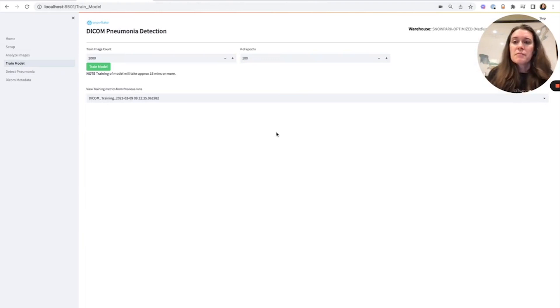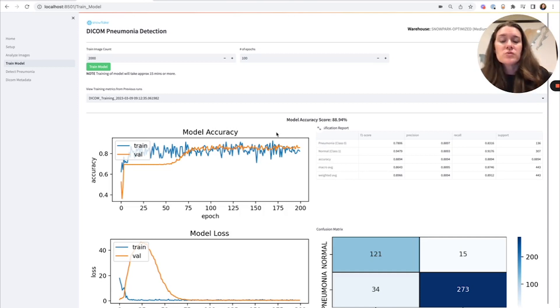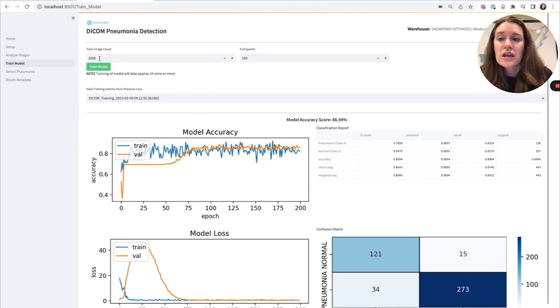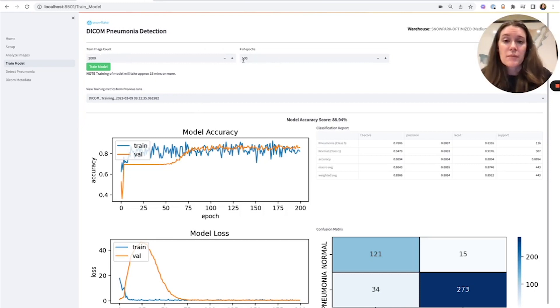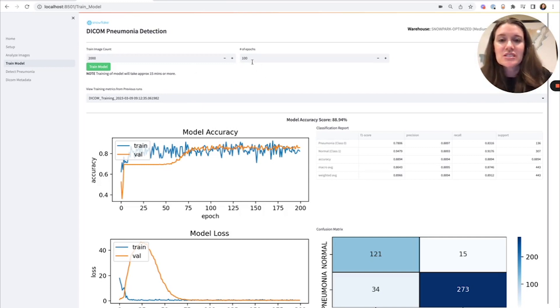When I want to train my model, I'm using TensorFlow. Here I have a couple of parameters I can set. The stored procedure to train the model has already been created, so I'm calling that stored procedure with the images and parameters I want. For instance, I can vary the size of the training set and the number of epochs in my TensorFlow model, and then actually train the model. It takes about 5 to 15 minutes depending on how many epochs and how many images you choose.